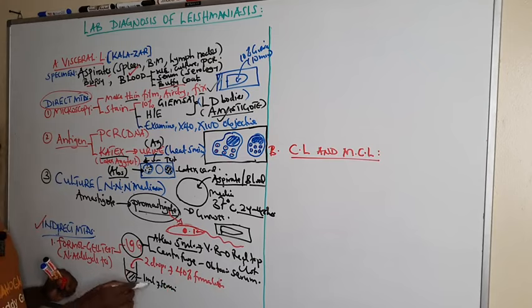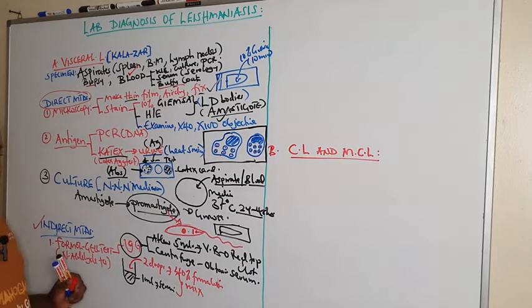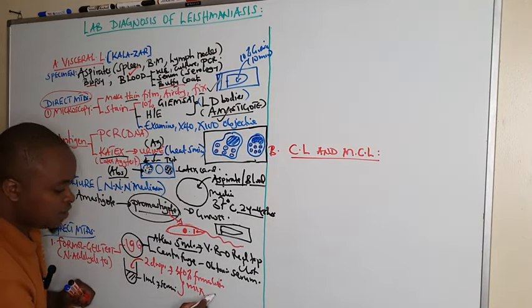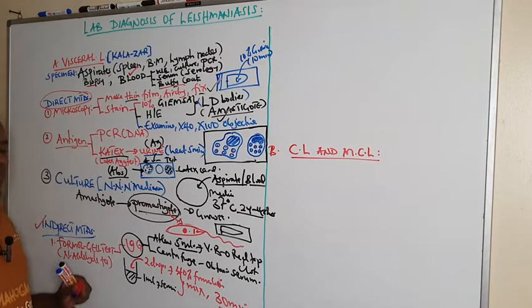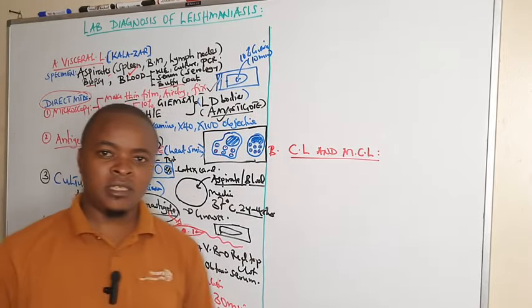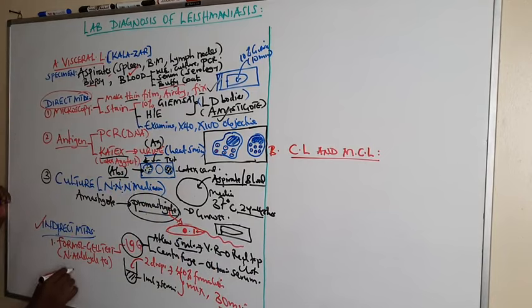Then you mix. After mixing, you incubate for 30 minutes at room temperature, and look for the presence of whitening and gelling.